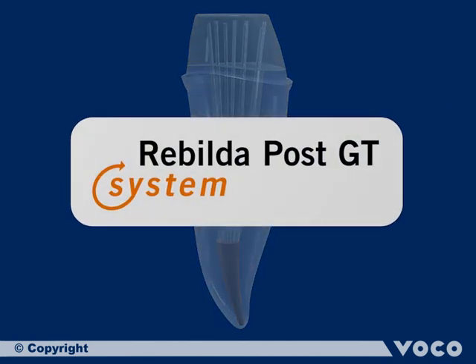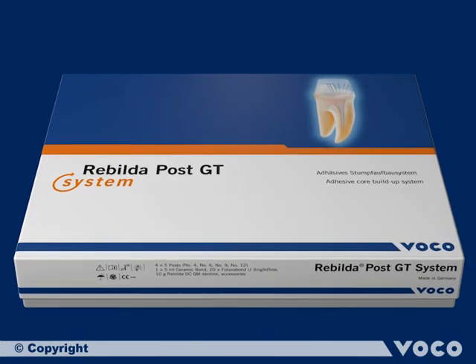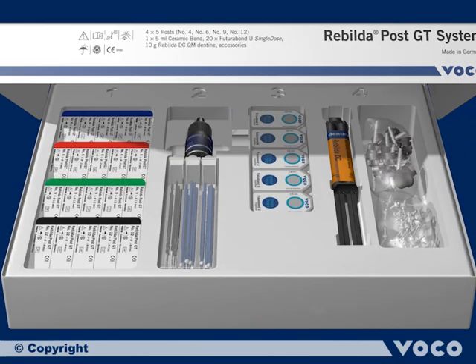Rebilda Post GT — a new type of glass fiber post for core build-up. It is available as a single blister or as a set.